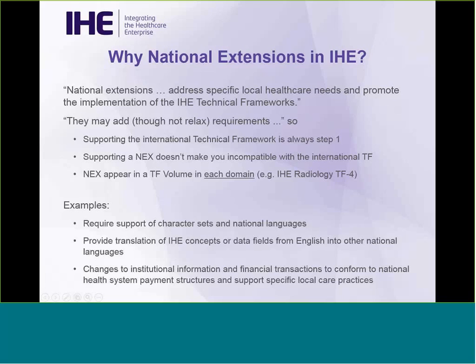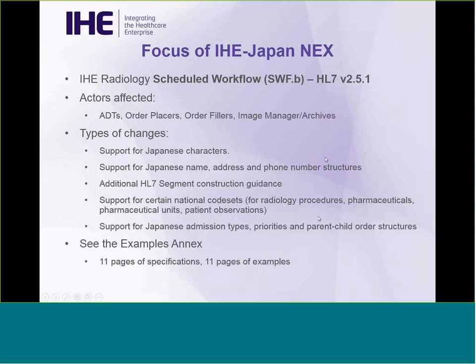So some of the things that will go in here typically are requirements to support certain character sets and languages, possibly translation of certain concepts, and then there'll be details related to how billing and institutional management is done within the different healthcare systems. So the focus of the IHE Japan National Extension in particular is Scheduled Workflow.b.